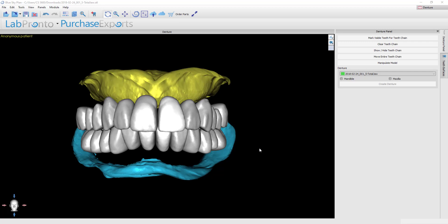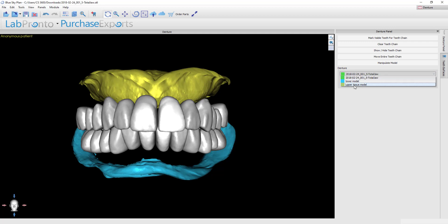With the teeth now set, we're ready to move forward with making the denture bases. First, select the model that we're going to be building the denture on. For this example, I'm going to do the upper denture, so I want to go in the drop-down menu and choose the upper tissue model, then click on whichever corresponding jaw you're doing.